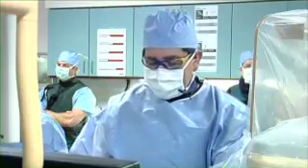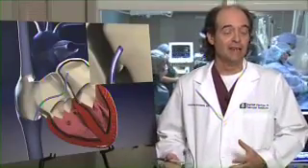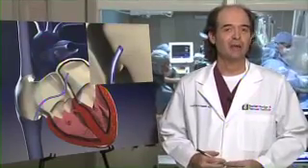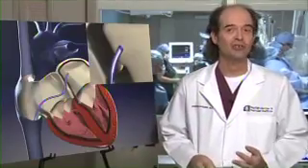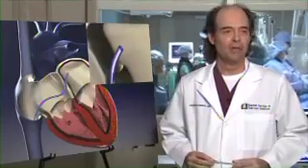I think it's so important what you just said. If there's another cause of a stroke, someone has an irregular heart rhythm that you mentioned, atrial fibrillation, if you put a PFO closure device in, you're not treating the cause of the stroke. So as Dr. Quesada mentioned, you have to have a complete evaluation for the stroke that includes your neurologist and a cardiologist, and I want to stress that. I think it's important.